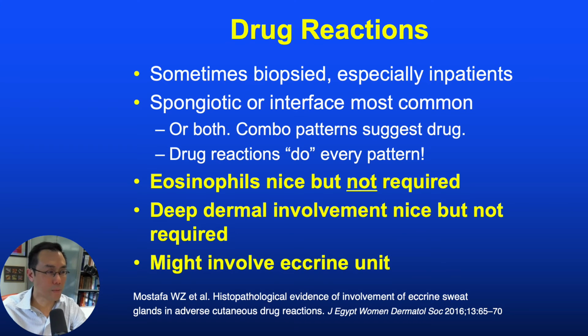And here we also have an opportunity to perhaps debunk the dogma about eosinophils in drug reactions. And so while we continue to look for eosinophils to support a drug reaction, and we sometimes question a diagnosis if we can't find them, in fact, it's well documented that you do not need to have eosinophils in a drug reaction. So while it's nice to see them, they are not required. What is required is clinical confirmation. Perhaps similarly, it's said that deep dermal involvement of the inflammatory infiltrate supports a drug reaction, but again, not required.